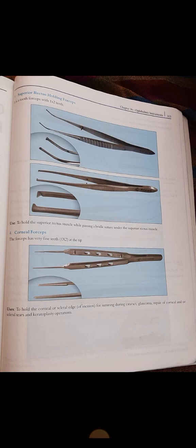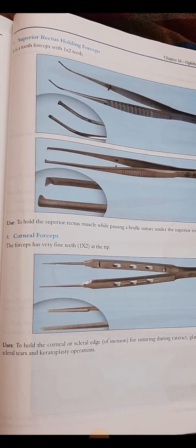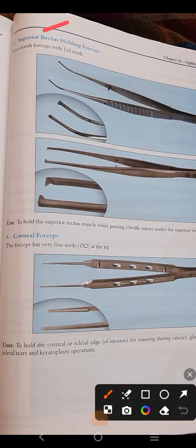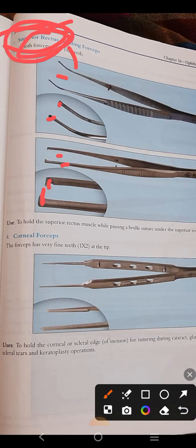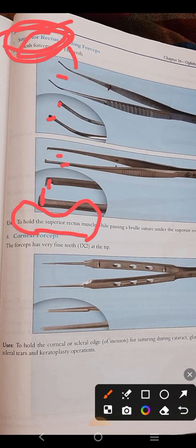The superior rectus holding forceps — its tip can be either curved or straight, but at each tip there is a single tooth present. You can see clearly that a single tooth is present on each tip, making it a tooth forceps. Remember: superior rectus is a single muscle, so it has a single tooth. As the name indicates, it is used for holding the superior rectus muscle when you want to pass a suture under this muscle.